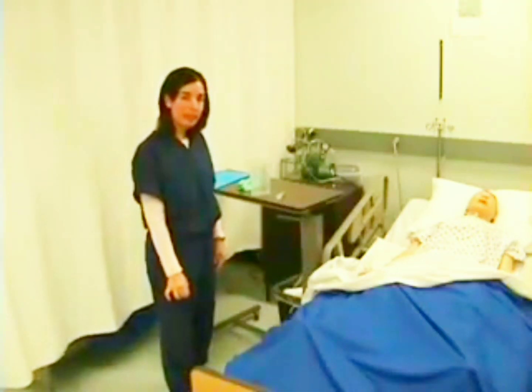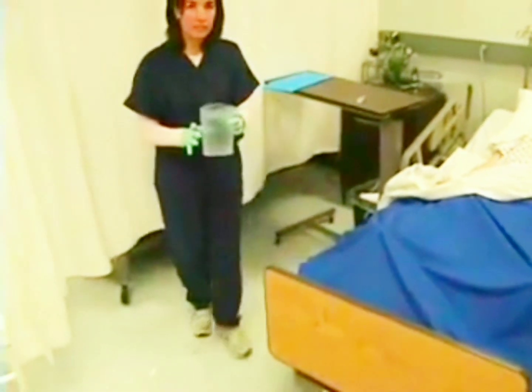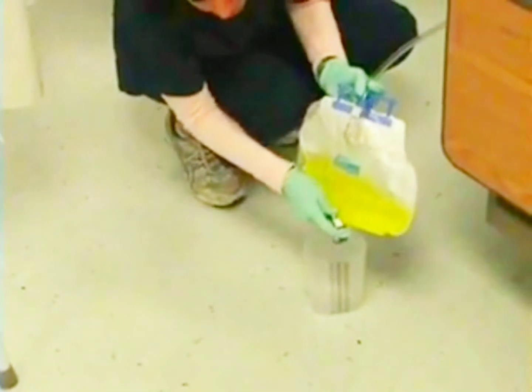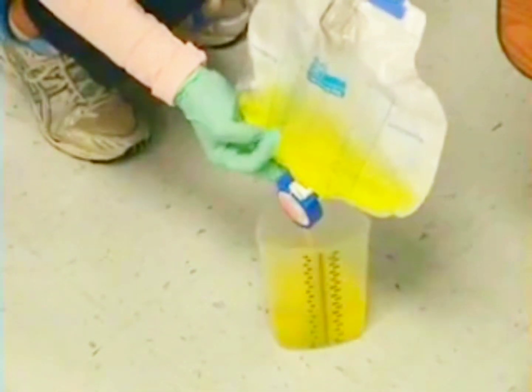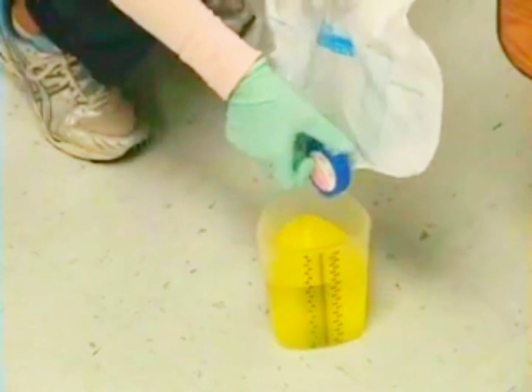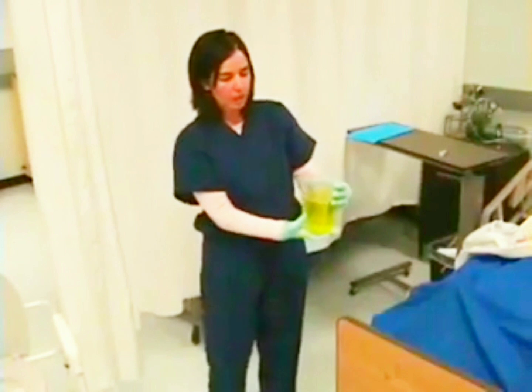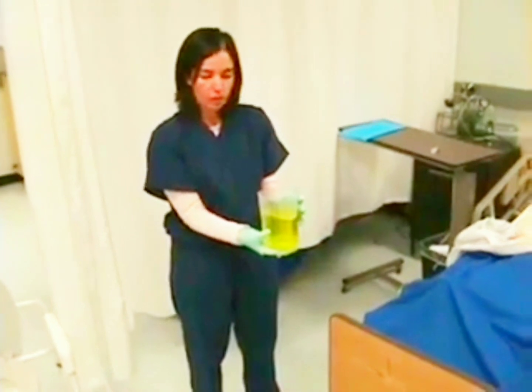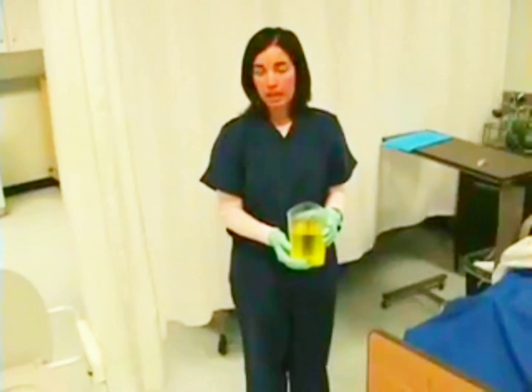Now I will provide privacy for my patient and empty my drainage bag. I'm going to put on my gloves and with my graduated cylinder, I will open the valve and measure the urine, then close the valve on my drainage device. I want to note the amount — it is 700 ml. I'm also noting the odor; there is no odor. The color is clear without any sediment.